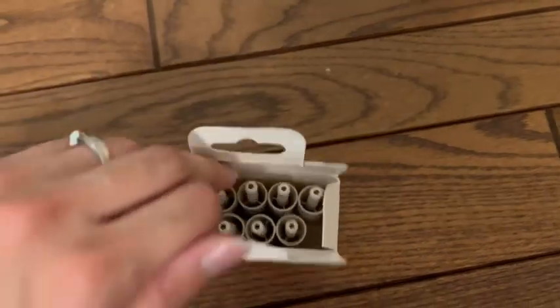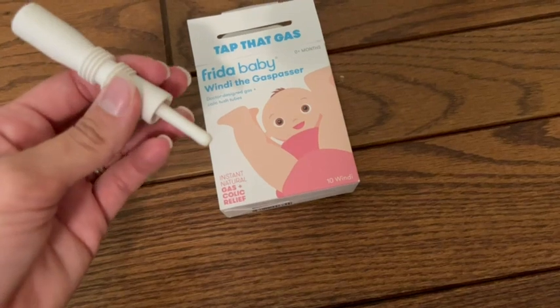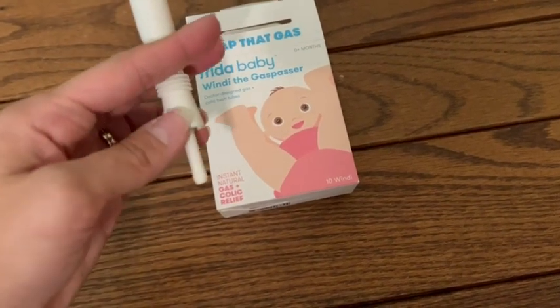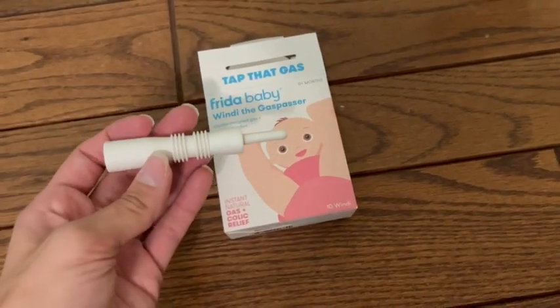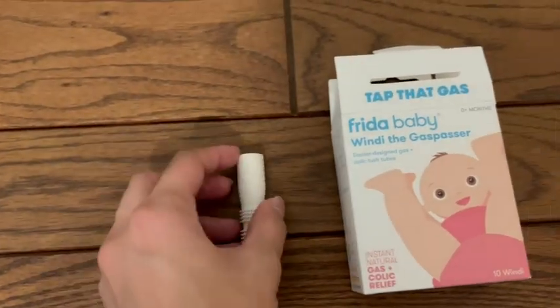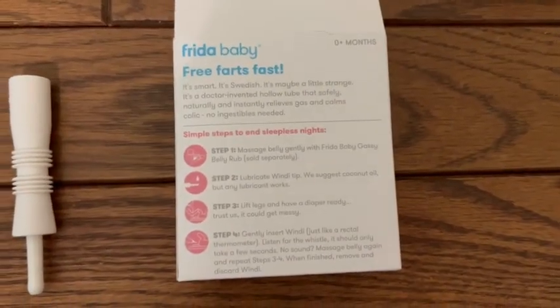I'm just going to show you one of them here. All you do is insert that end and it has a stopper right there. I would recommend using a lubricant such as Vaseline or whatever is recommended, and then you simply just wait and it will make like a little whistle noise. I love that it's kind of foolproof and it really helps with colic and gas relief, and there are some steps on there to help as well.